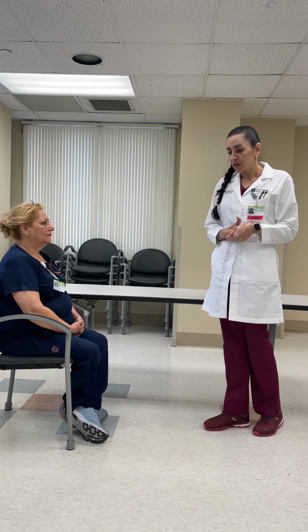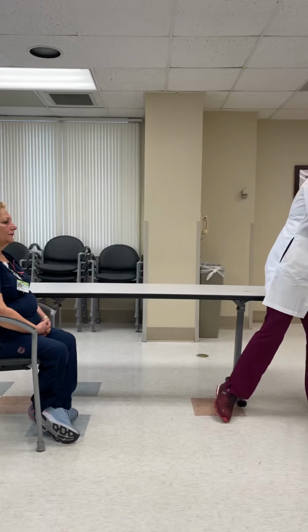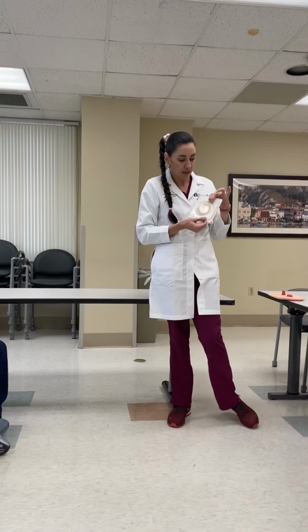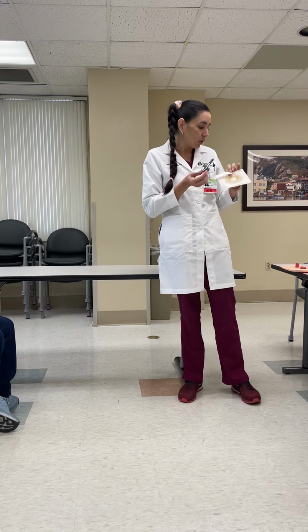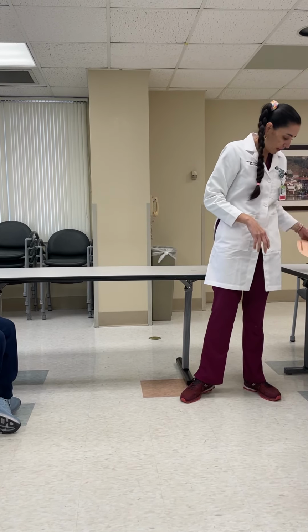The first thing that we're going to do in the patient is usually use the marking disc. This is a wafer from one of them, and we're going to use a marker or pen to do it. And this is an example of the ostomy, also to do education for the patients.